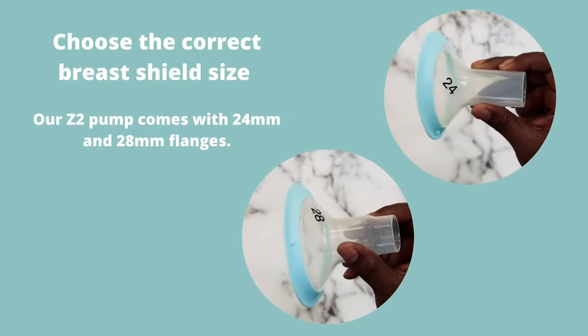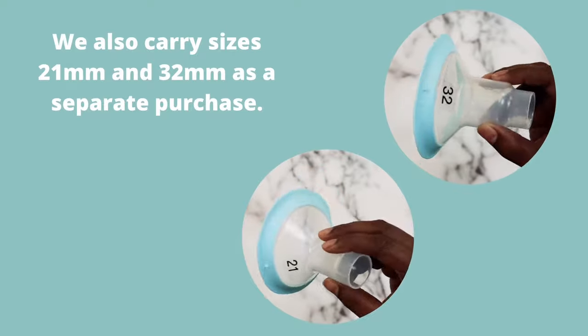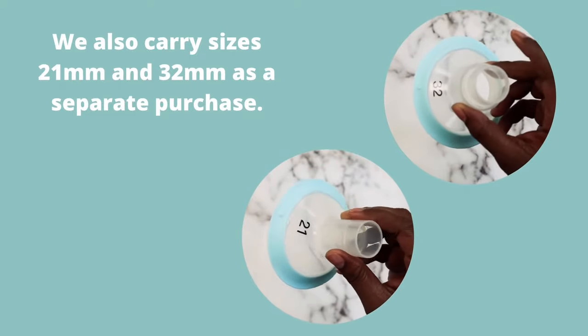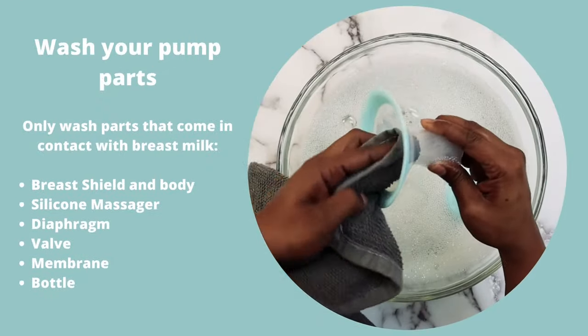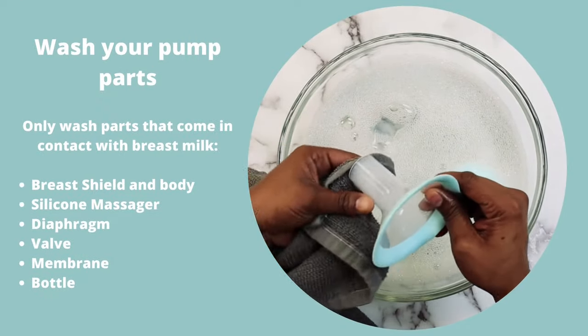Preparing to Pump. Choose the correct breast shield size. Our Z2 Pump comes with 24 and 28 size flanges. We also carry sizes 21 and 32 as a separate purchase. Wash your hands. Wash your pump parts — only wash parts that come in contact with breast milk.